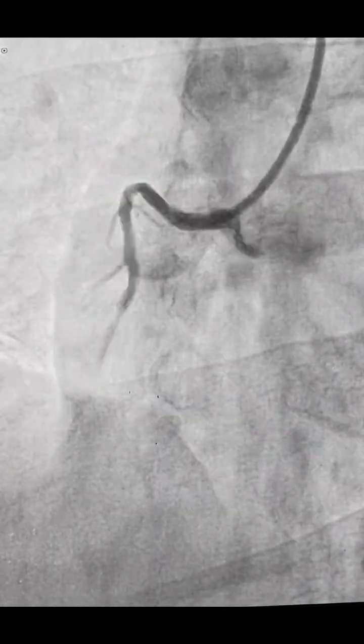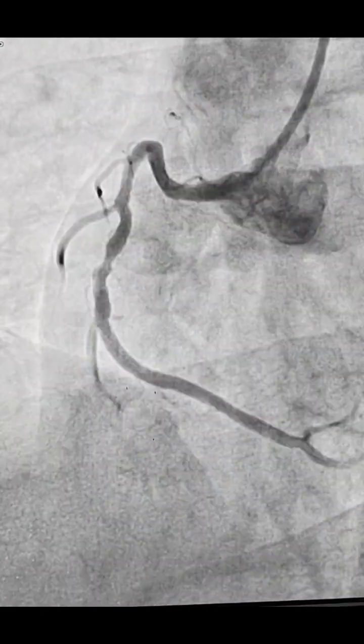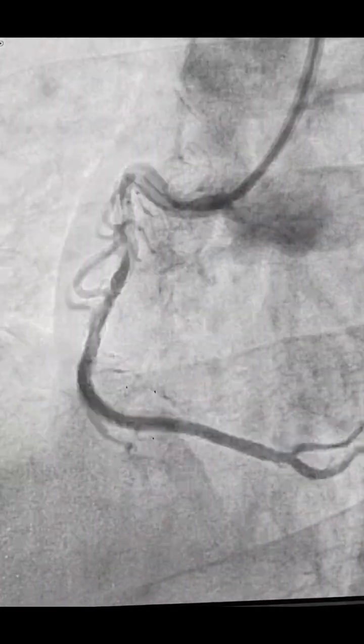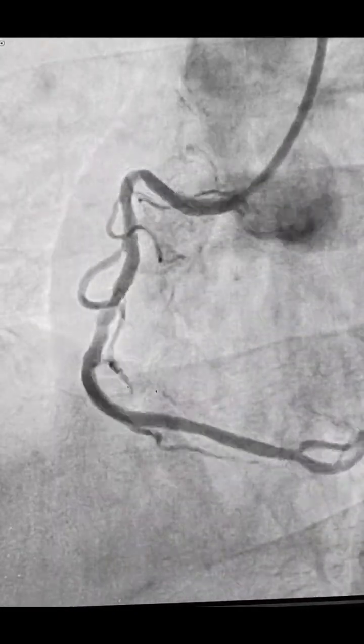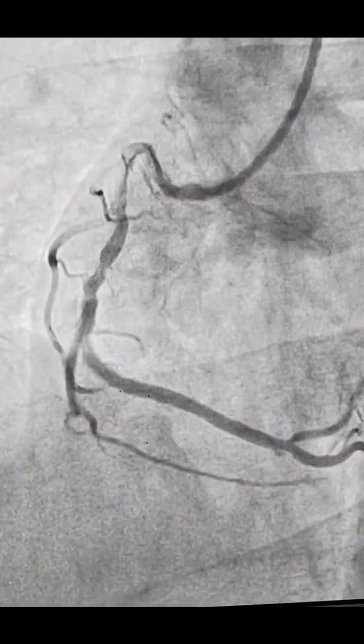So this is the RCA. You can see this is a Shepherd-Crook RCA. This is the right radial route with the JR catheter, and you can see the Shepherd-Crook RCA with a significant lesion in the mid RCA. I'll show it in the other view.